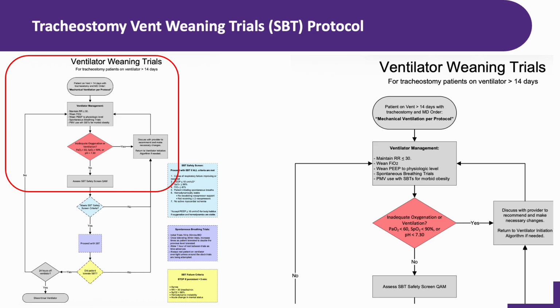Fourth, and this is the liberation piece, initiate spontaneous breathing trials. Even though these are long-term ventilated patients, we are still training them for liberation. The approach is just more gradual and progressive compared to our acute patients.